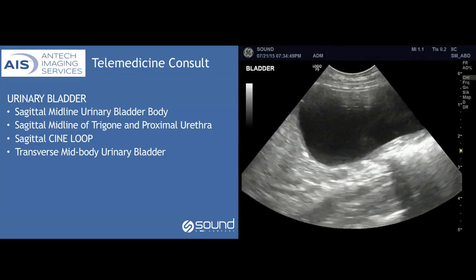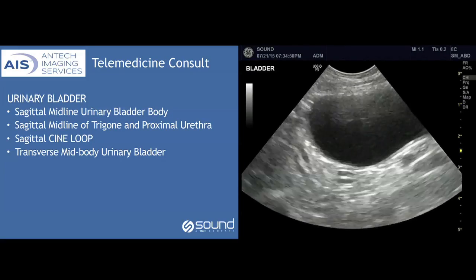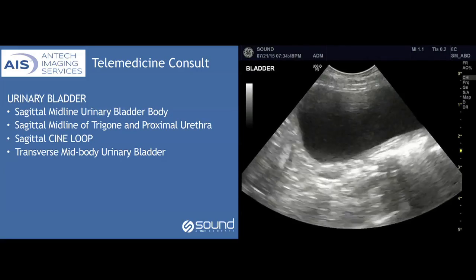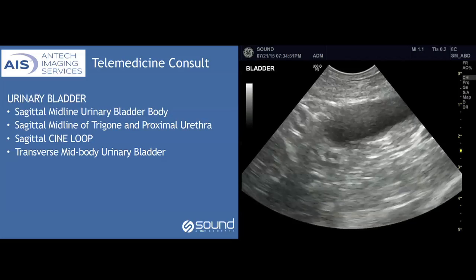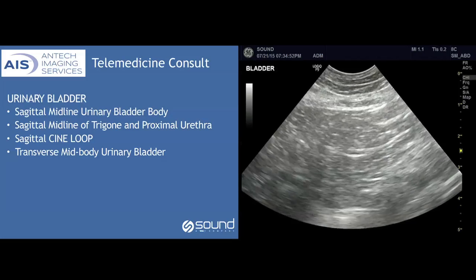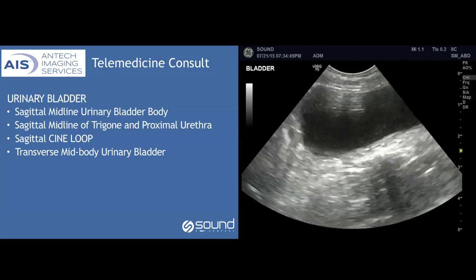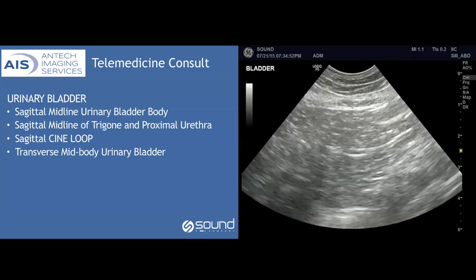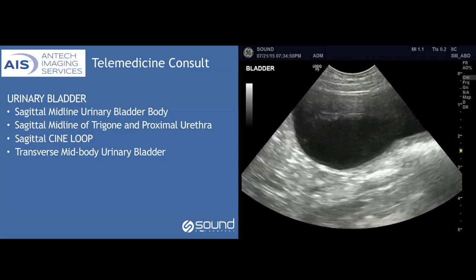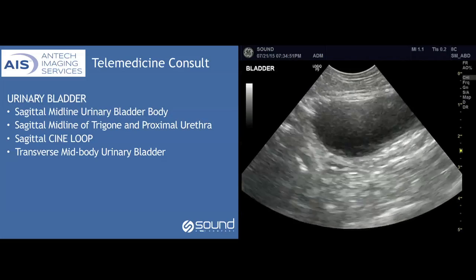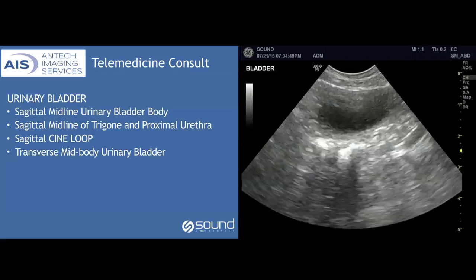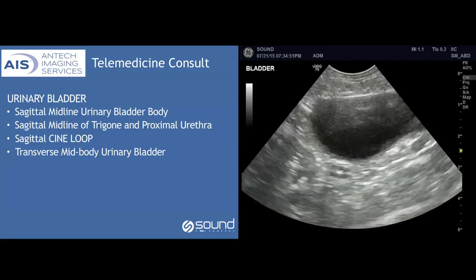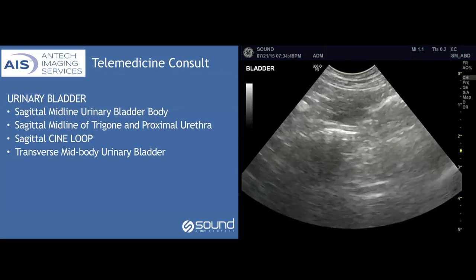Having a cine loop of 3 to 5 seconds going through the urinary bladder in a cranial-caudal direction — in both the urinary bladder and in the urethra — will help us evaluate not only the prostate gland if present, but also to look for urethral obstructions as well as looking at the trigone region for any obstructions with ureteral papilla.